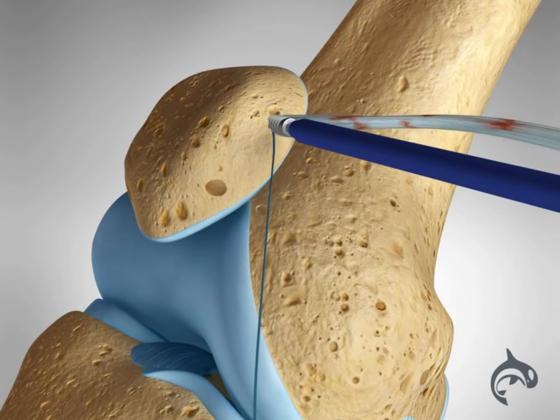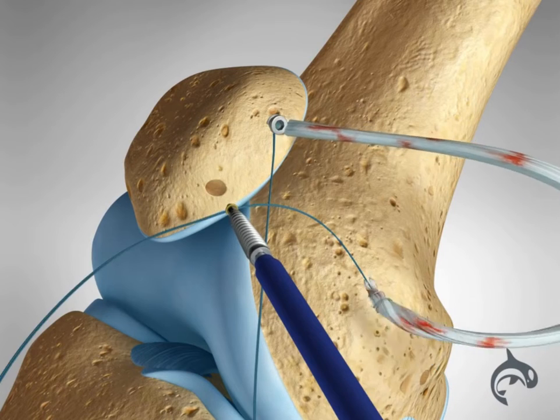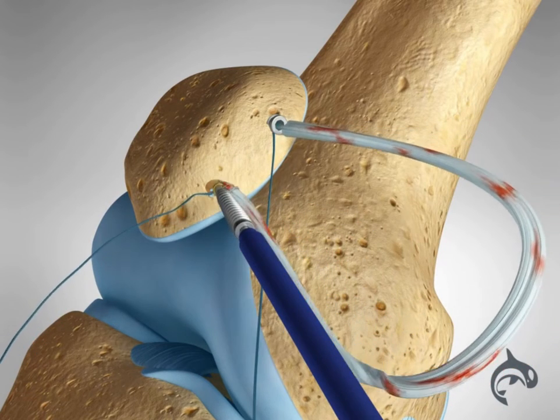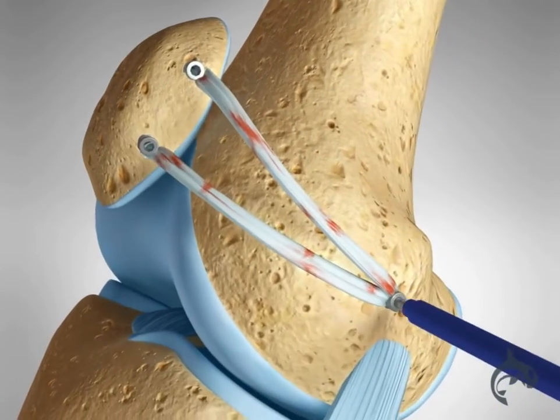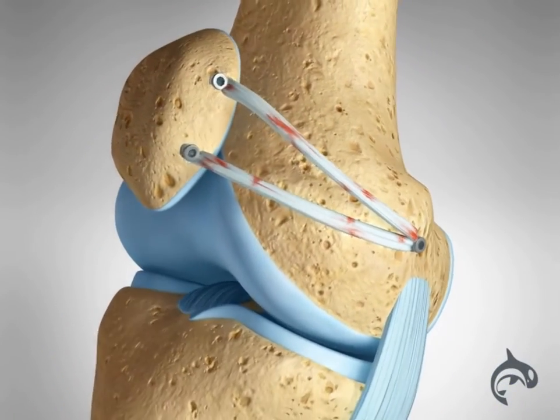The graft will be tensioned to ensure that it will prevent the kneecap from dislocating, without putting undue pressure on the knee joint. Reconstruction produces excellent results and has a very low rate of complication.